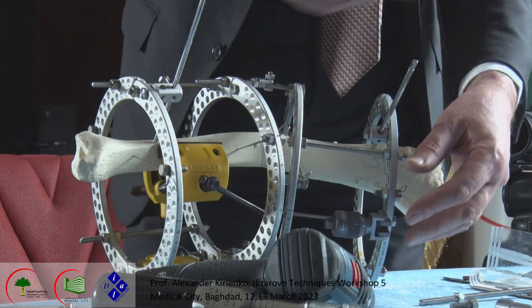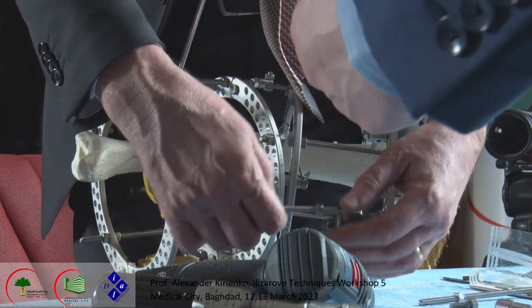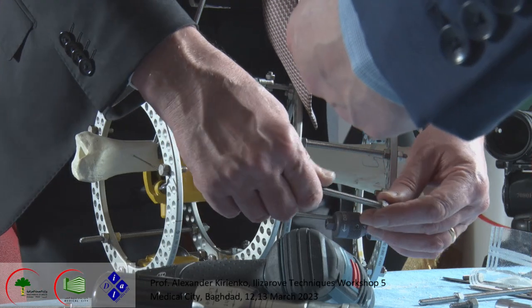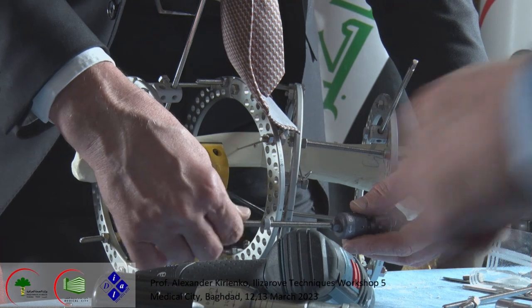Okay. I put this because it's going inside. No, I put the wrong one. I put a little bit longer.